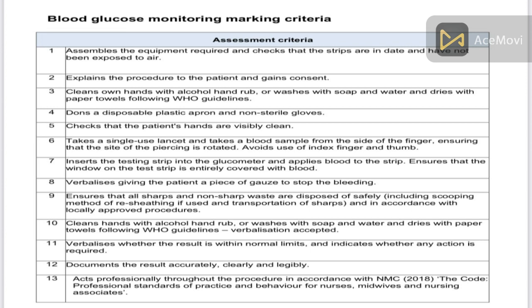Let's go to the patient side. Now I am going to check your blood glucose level. Are you still happy to proceed? I am going to do the hand gel and hand washing — palm to palm, right palm over left palm, interlacing the fingers, interlocking the fingers, thumb-end rotation, nail beds rotation.